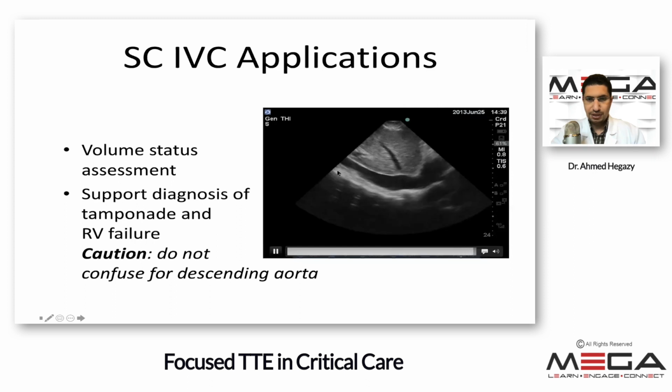But if the IVC is not collapsed, that does not rule out volume responsiveness. They could still be volume responsive with an IVC that's not collapsible. And so I'm going to say this, take it with a grain of salt.